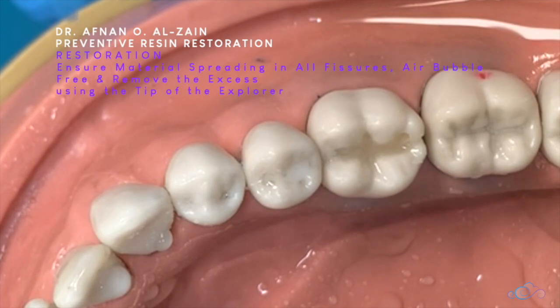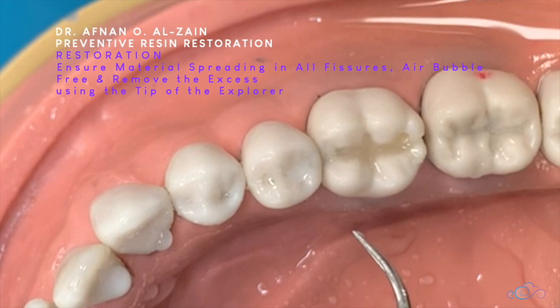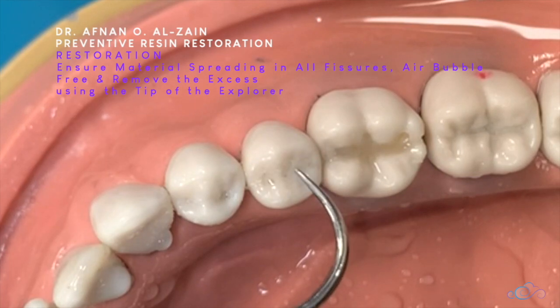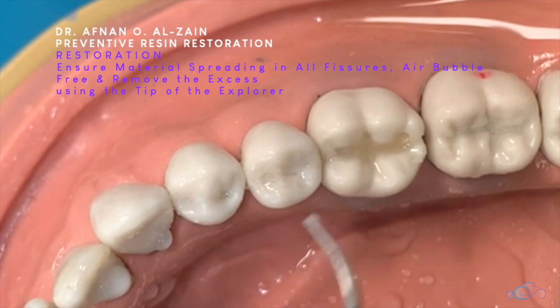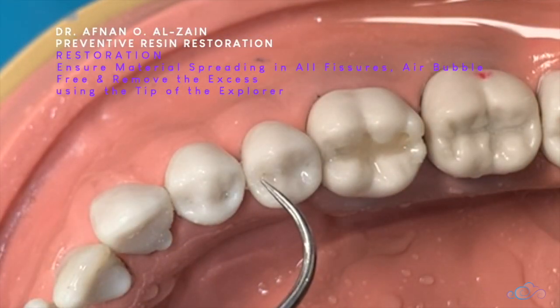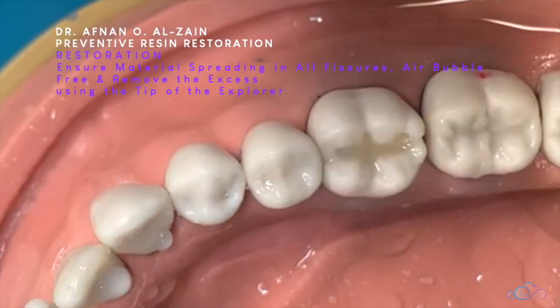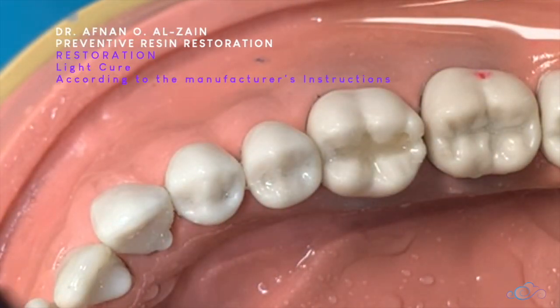Using the tip of the explorer, we put it on the groove and remove any excess. We make sure there are no air bubbles — any air bubble will make the restoration defective, and you can get an area of bacterial infiltration. We are protecting the whole groove from possible decay.